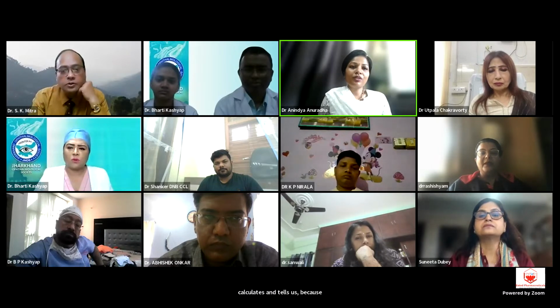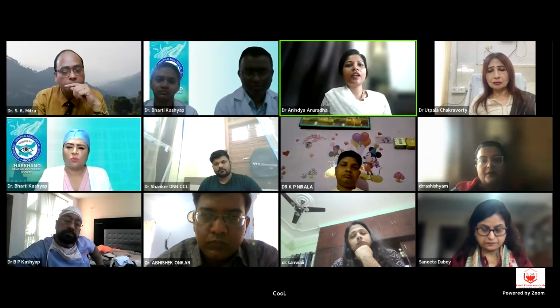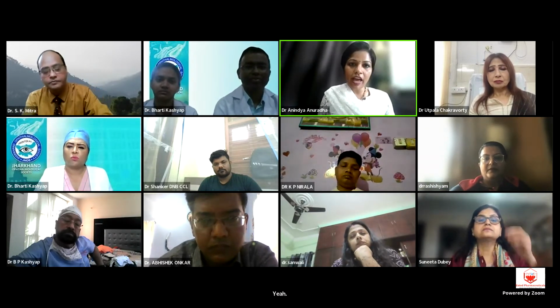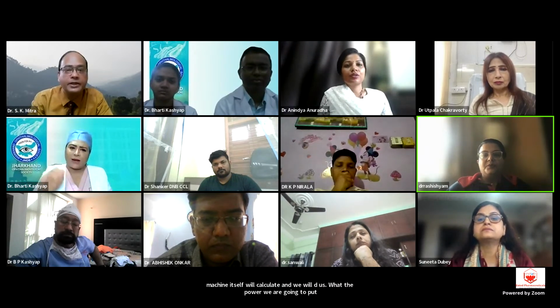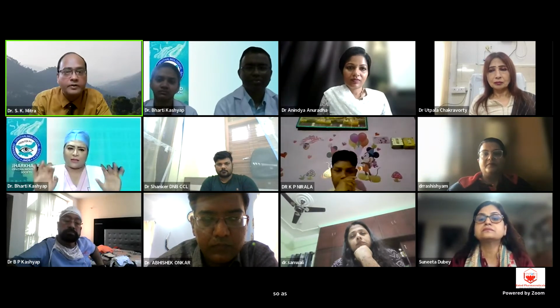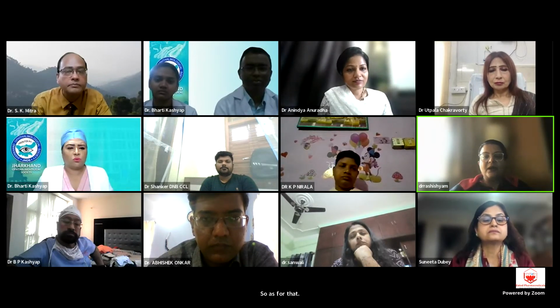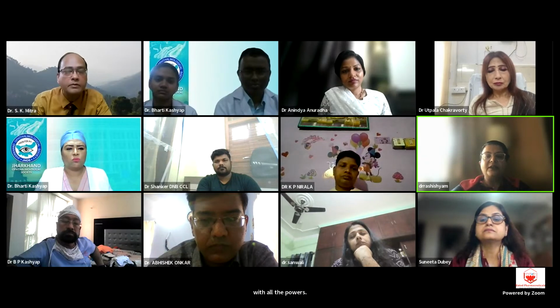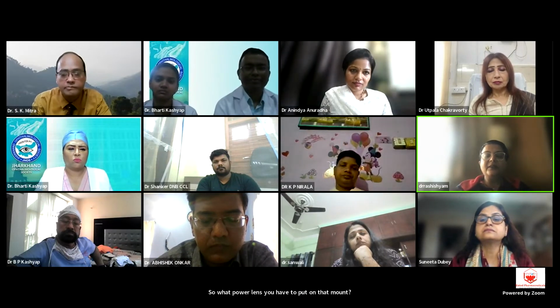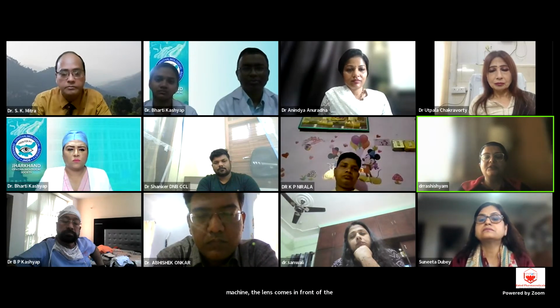Suppose yes, ma'am. You both are actually correct. With the upgradation of the machines, the machine itself will calculate and guide us what power we are going to put. Exactly. Humphrey, after entering the patient's data, gives the spherical equivalent. It tells you a power. And then there is this mount on which a trial set comes with all the powers. What power lens you have to put on that mount, the machine will tell you. That lens is fitted onto the mount, and then when the patient puts the chin on the machine, the lens comes in front of the eye, and through that the patient sees and does the field.